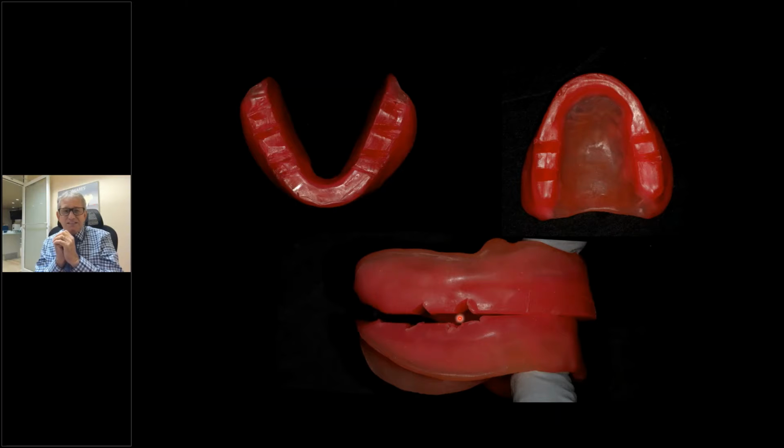I want you to bite down, stay on those occlusal rims. I'm going to pull your cheek out, and now you're just going to squirt some bite material right here. You already put some notches on this, and you can just put some bite material right there. They're not going to bite, because if you tell a patient to bite, they always want to incise. They always want to come forward. Anytime you say bite, it's just going to happen, so we don't want them to do that. Just close, and then have them bite right into the material, down into the occlusal rims of the wax material, and then just squirt the material inside that little opening.